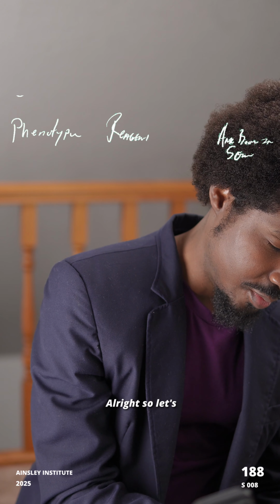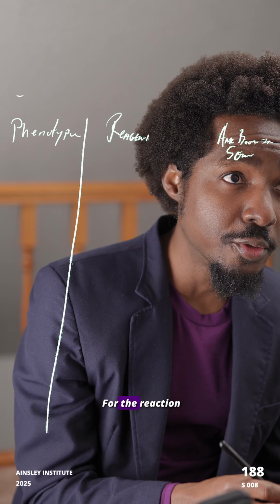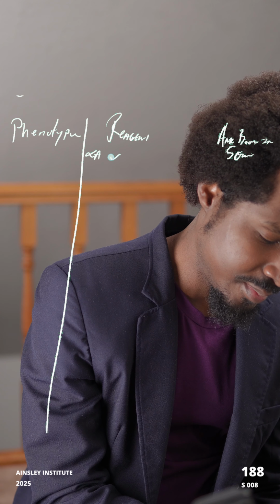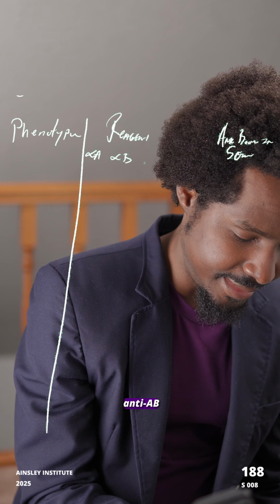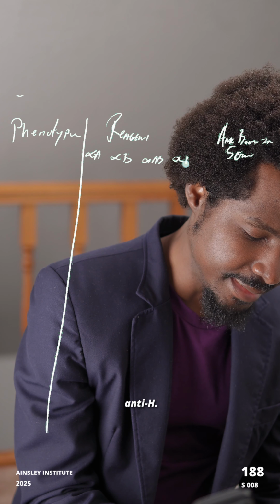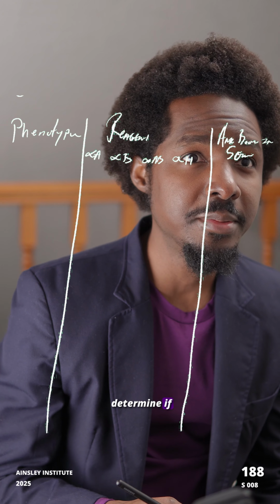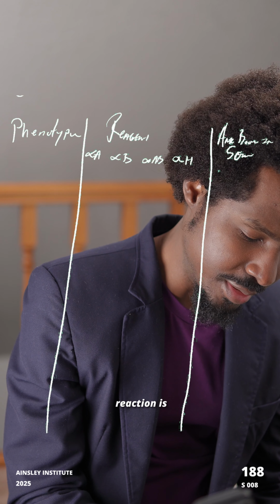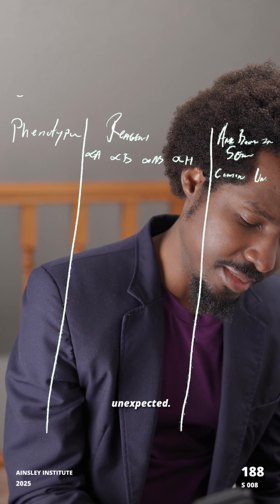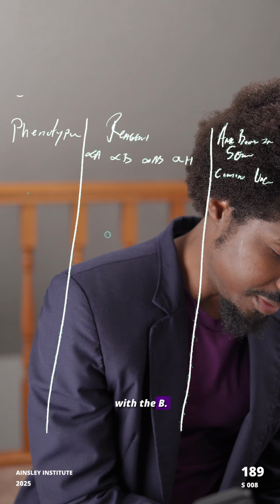All right, so let's bring it down. For the reaction of the reagents, we want to think about the anti-A, anti-B, anti-AB, and anti-H. Then we want to determine if this reaction is common and unexpected.